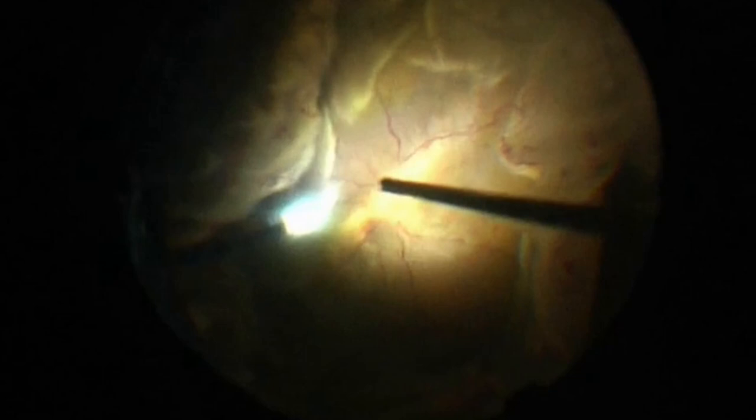During the vitrectomy, it's possible to see a total retinal detachment associated with a giant retinal tear supertemporally. The retina was very mobile with anterior folds and ciliary body detachment. In these cases, it's important to be careful during trimming of the vitreous base to avoid iatrogenic breaks.